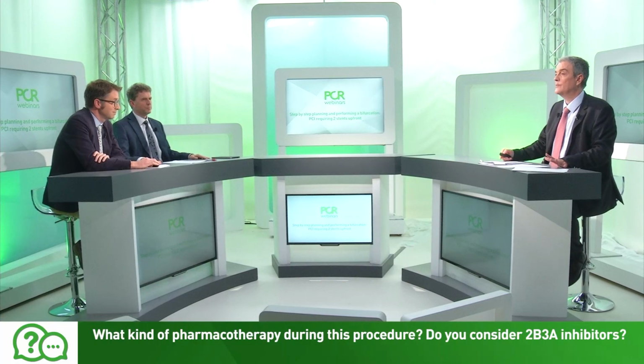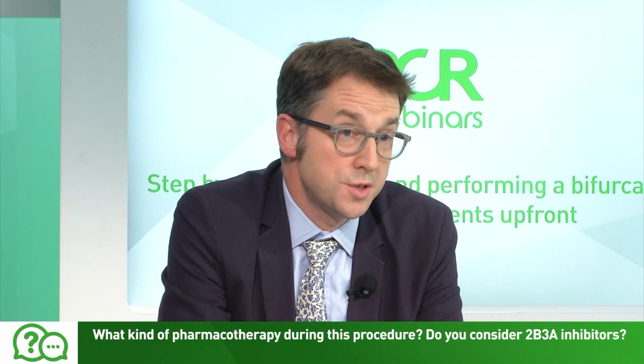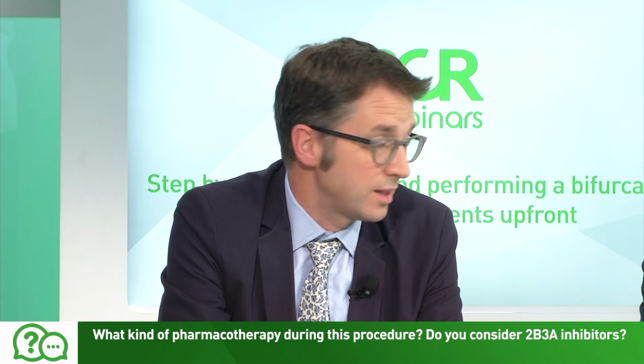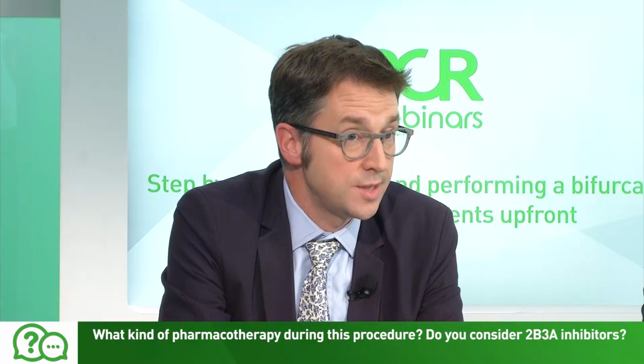The last question is what kind of pharmacotherapy during the procedure would you consider to be appropriate? Although the patient presented with the occlusive circumflex, in fact, it reopened, recanalized very promptly. We just used unfractionated heparin with ACT guidance.